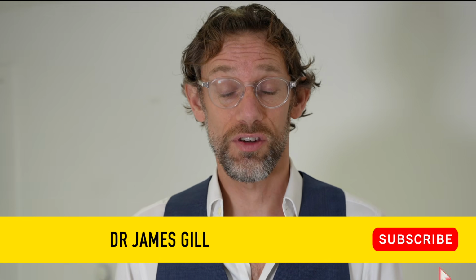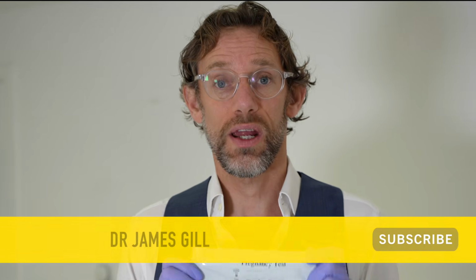My name's Dr. James Gill and you've joined me for a video on how to perform a pregnancy test. This seems like a relatively straightforward test to do. However, it's actually very important from a medical legal perspective.